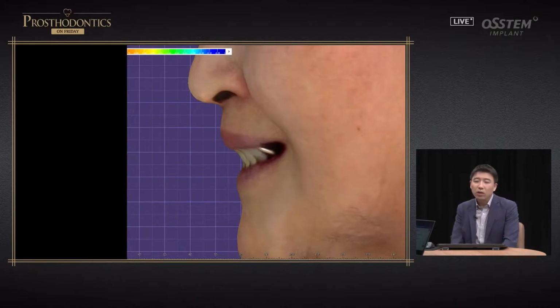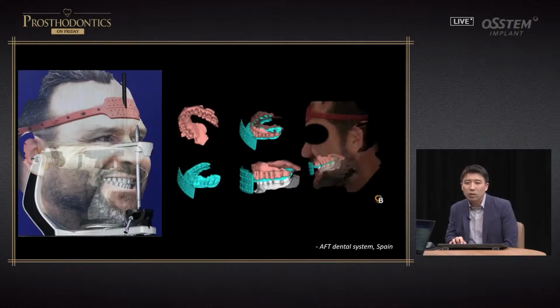There can be scatter and scanning may not be done properly. You can put some powder on teeth to prevent the scattering. You can also use jigs. At present, if you put the scan data and merge it, the accuracy will decrease significantly. There are many ways to solve it.